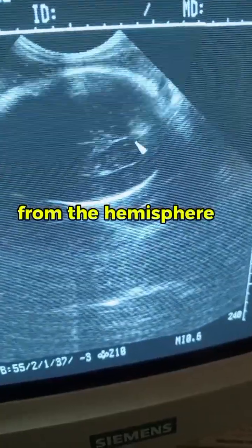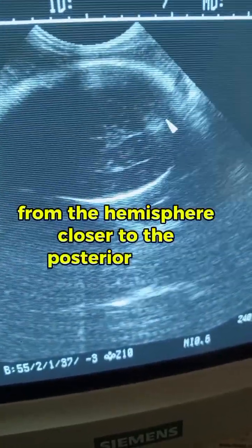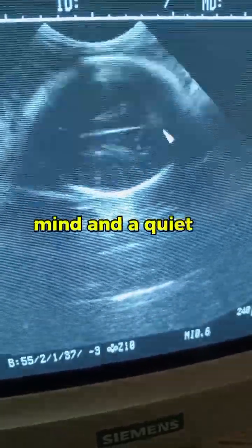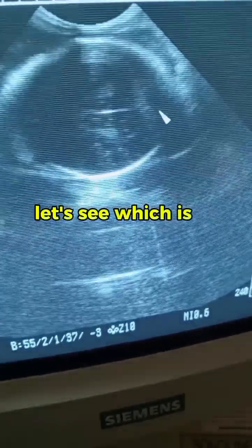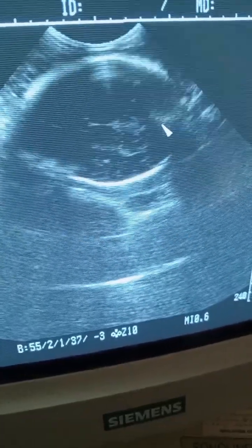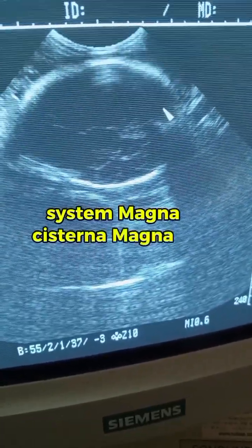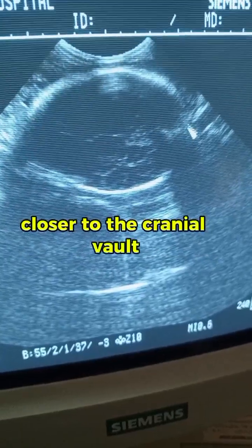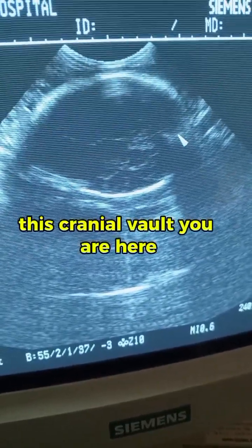From the hemisphere closer to the posterior fossa, you see a very minor anechoic region here, which is known as the cisterna magna. The cisterna magna is within this area, closer to the cranial vault. This cranial vault you are seeing here.